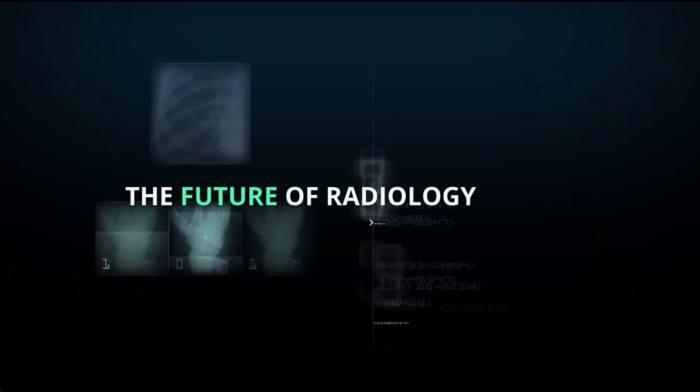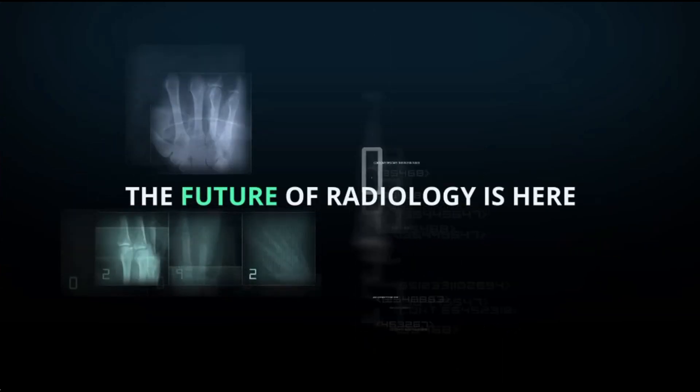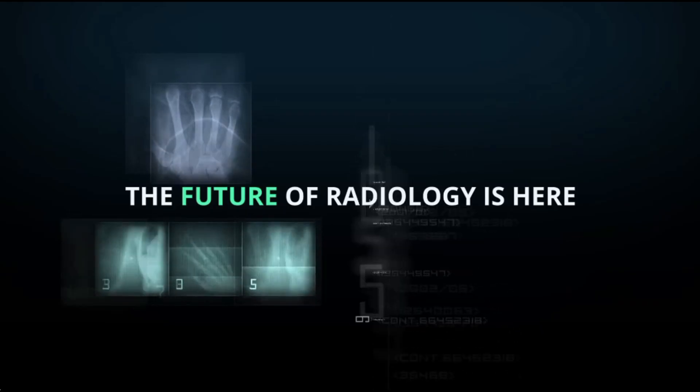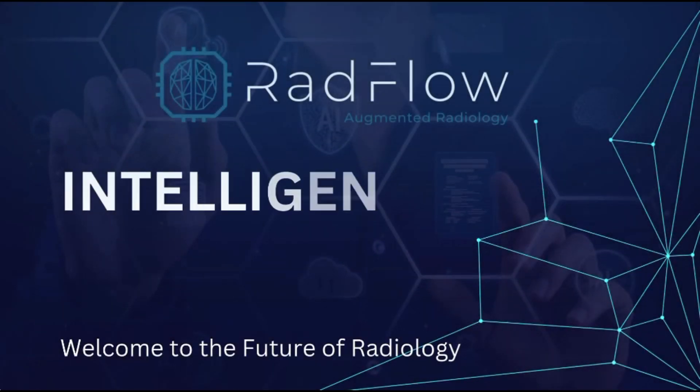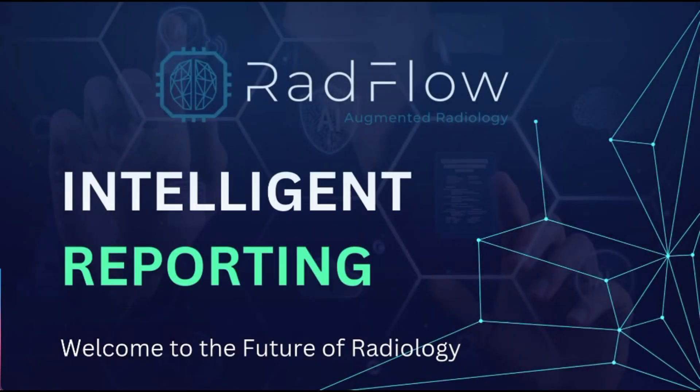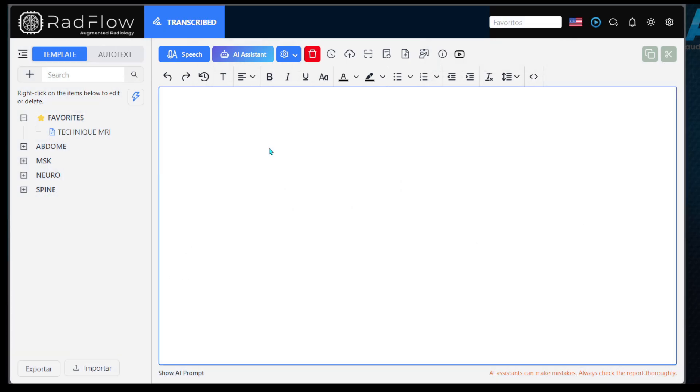This video will teach you the basic functionalities of the Radflow platform, an artificial intelligence solution designed to streamline and organize the creation of radiology reports.